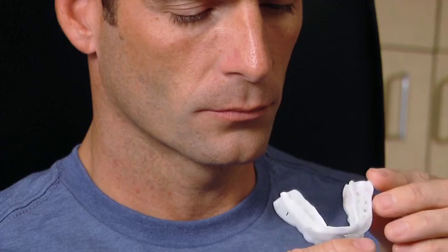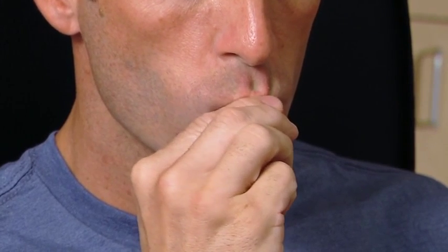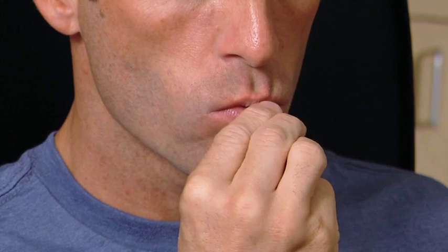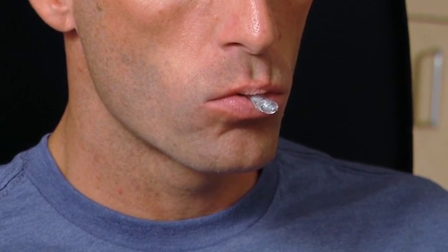Before daily use, inspect your myTAP. If you notice any defects, do not use it and contact your prescriber. Place both trays in the mouth. Make sure that the lower tray is not dialed too far forward because you may not be able to bite into the appliance. Gently relax your jaw once the myTAP is in your mouth.